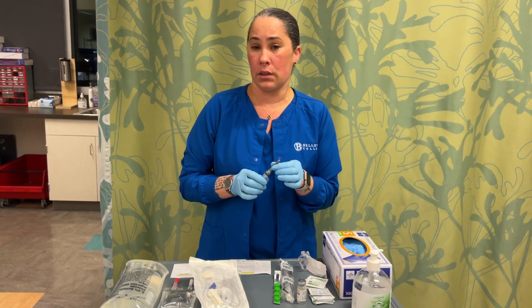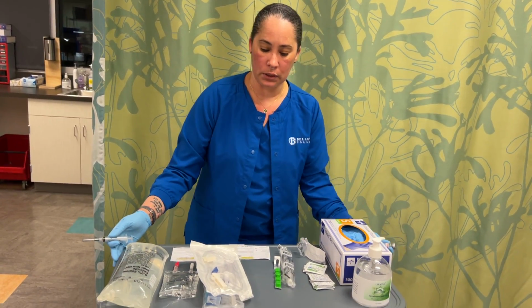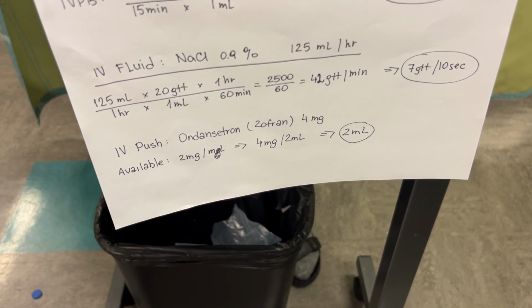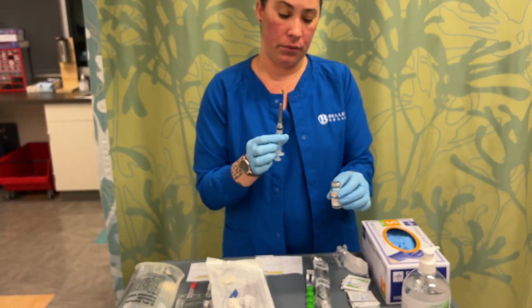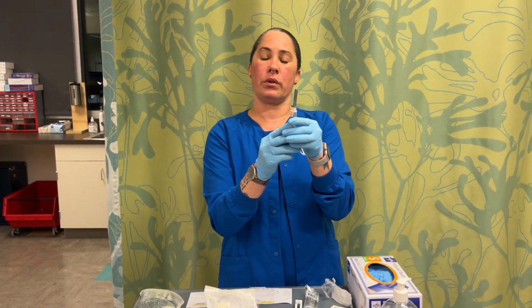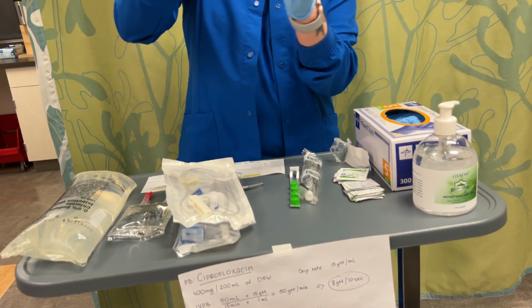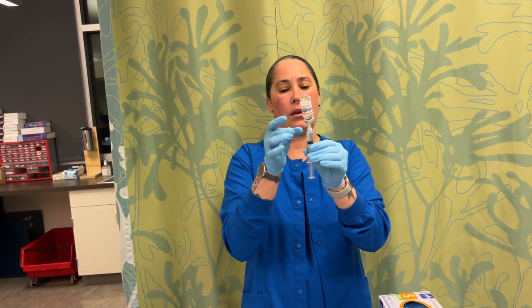So the order for the ondansetron calls for 4 milligrams of the medication. So if you want to look at our little cheat sheet here, it's going to be down there at the bottom. So it's going to be 4 milligrams ordered, and it is 2 milligrams per ml. And so we're going to draw up 2 mLs of the medication for it to be 4 milligrams. So you're going to fill the syringe with air, 2 mLs, and you are going to insert the blunt needle into the vial, air to air, and then you're going to want to flip it upside down, and you'll get that 2 mLs right back.